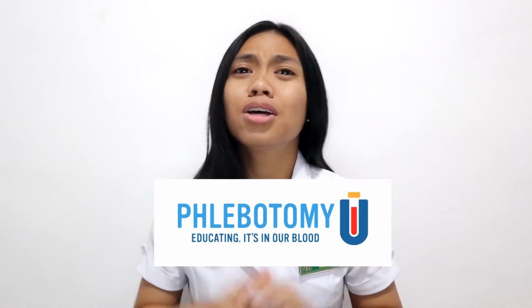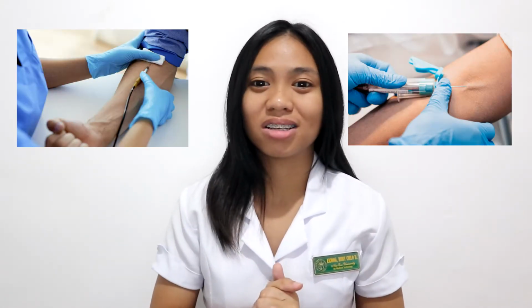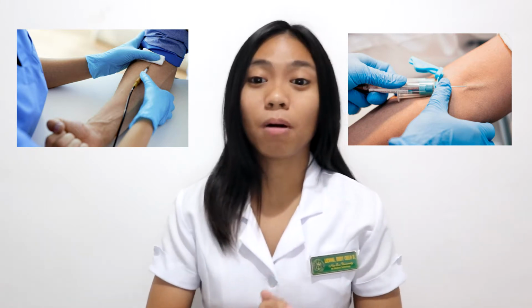So let us start first in identifying our topic, which is phlebotomy. So, what is phlebotomy? Phlebotomy is the act of drawing or removing blood from the circulatory system through incision or puncture. It could be a venipuncture, or cut through the veins, or a capillary puncture, or cut through the capillaries. Today, we will be focusing on venipuncture.